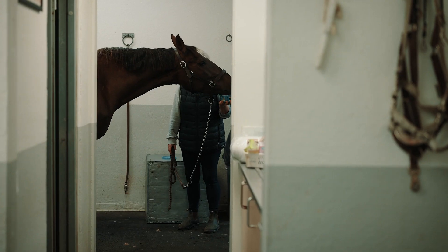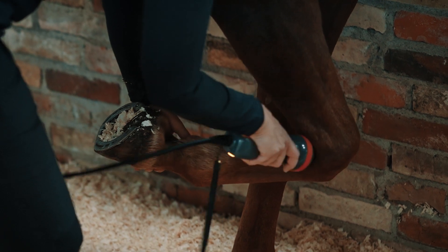We have done some chronic wound management on wounds that have been at the same level for a couple of weeks, and then we start the laser and it really gets the healing going.